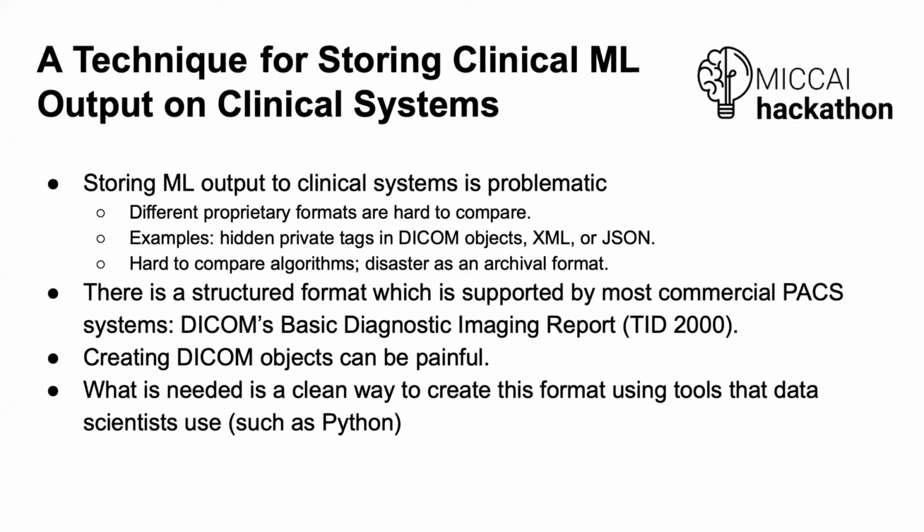I have a very, very narrow technical problem that I just wanted to solve, which is how to store very simple ML output, simple classification tasks, in a standards-based format that we could store archivally at the hospital, and that we could use to try to force vendors to standardize on a single output. Right now, at my hospital, we have a bunch of proprietary formats.